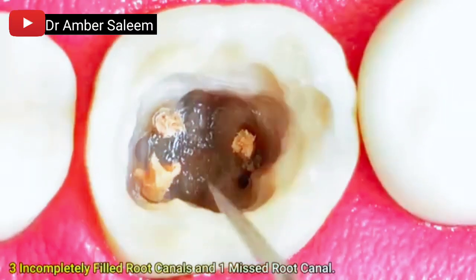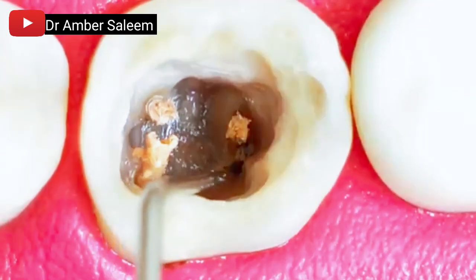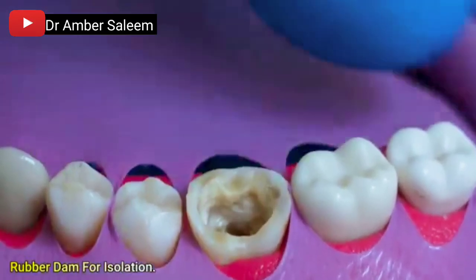Three completely filled root canals and one missed root canal are identified. Rubber dam is placed for isolation to maintain a sterile, dry operative field during the procedure.